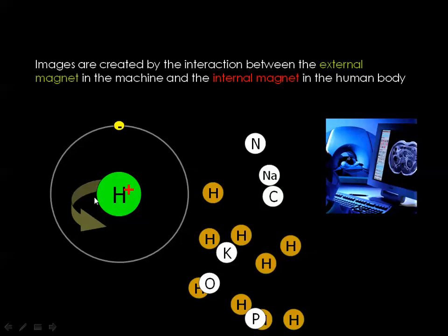protons or electrons. Before that, I would like to mention that the strength of the magnetic field created by the moving object is proportionate to the mass of the moving object.